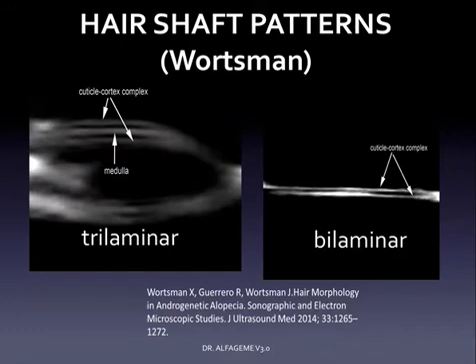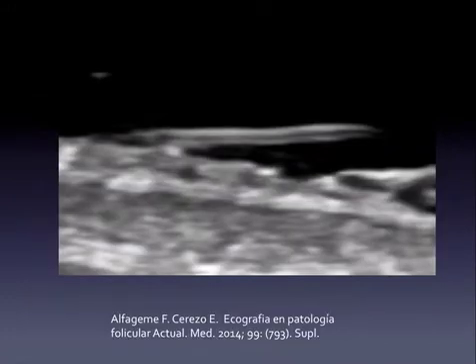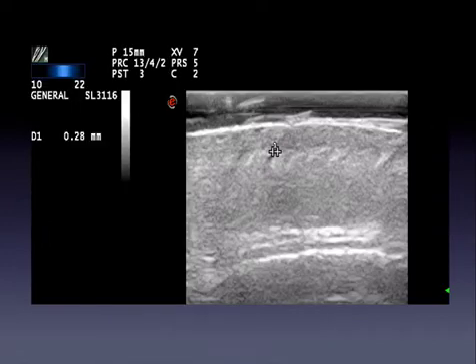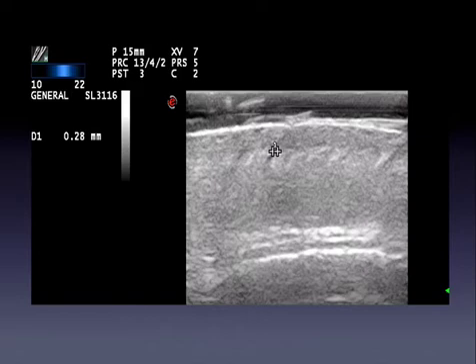Most hair on the scalp is trilaminar, whereas in other locations and in alopecia androgenetica it would be bilaminar. This is the structure of the hair shaft — you can see this bilaminar structure in a non-medullated hair shaft going obliquely into the dermis in the follicle that surrounds it. You can observe fine hypoechoic oblique lines corresponding to hair follicles in the anagen phase. Normal follicle thickness is approximately 0.2 to 0.4 mm.